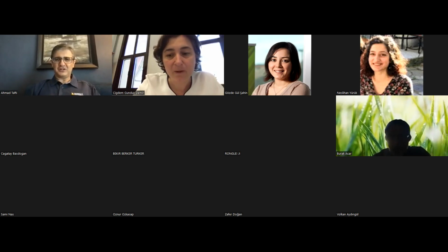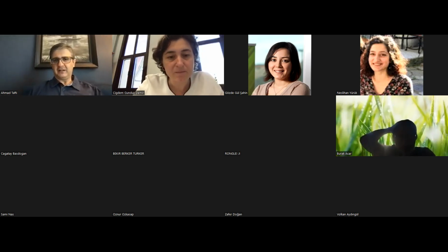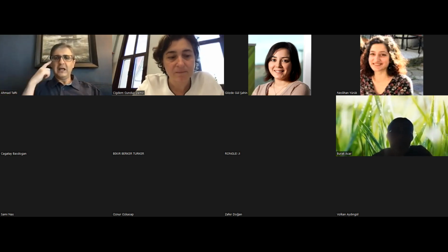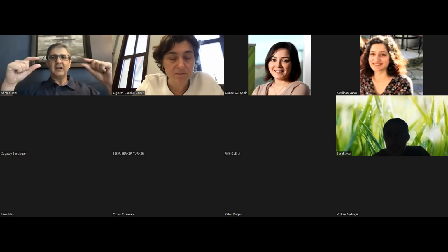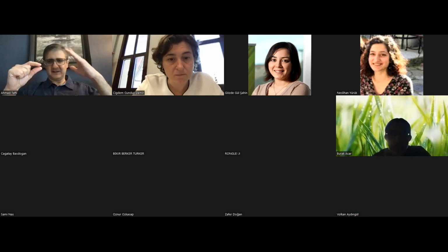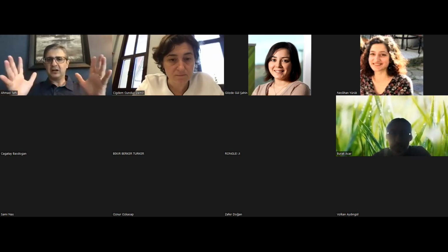Very, very nice, very good question, Shikdam. Let me tell you an example. One of the research activities we did in the past was about knee osteoarthritis grading. Grading knee radiographs into different grades in terms of knee osteoarthritis level. Our surgeons and radiologists look at those knee radiographs to come up with the results saying that this is grade 1, this is grade 2. It's mainly based on the gap or the space they can see within the knee joint space, right? If the knee joint space is narrow, the grade is, for example, 4. But if the knee joint space is bigger, the knee is going to be normal, right?